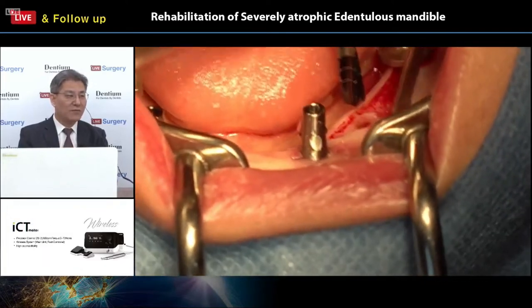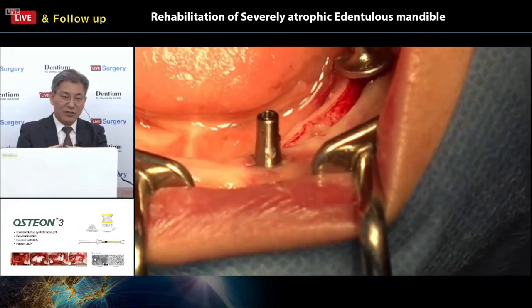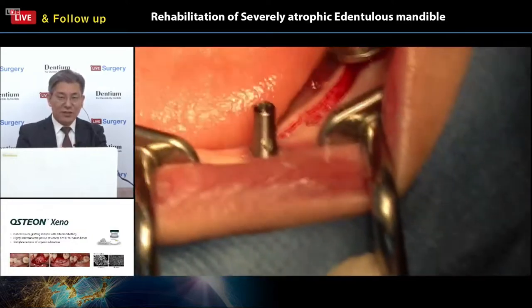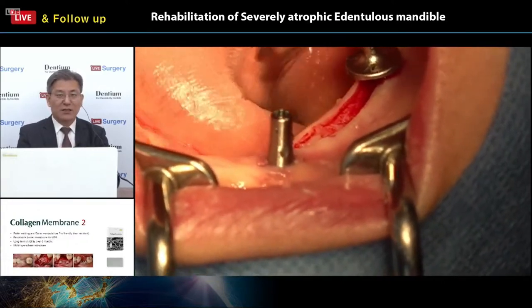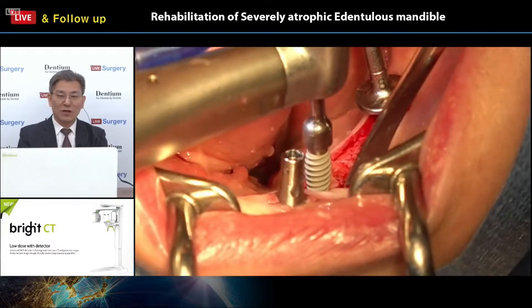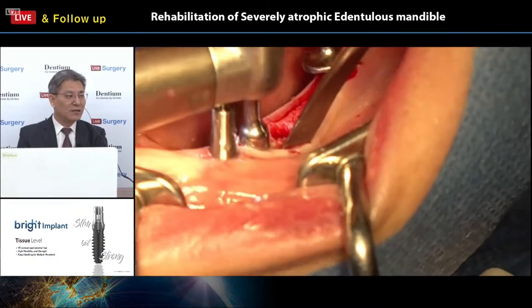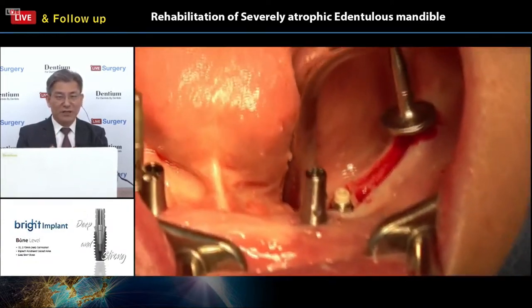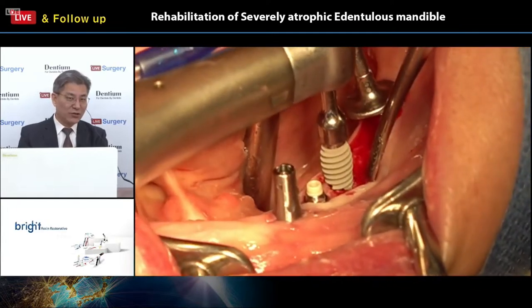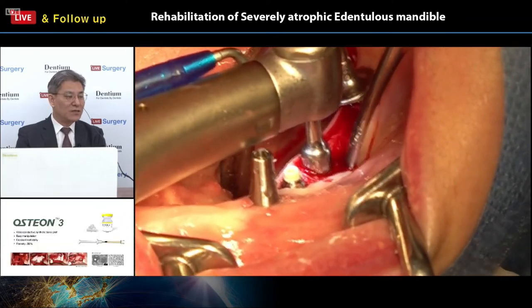This pin is a unique shape, a little bit like a dish style: a metal dish with a pole. So these metal dishes give us information about the final restoration, right? For the premolar, maybe 7-8 millimeter, the molar 9 millimeter, and the lower first molar, the biggest molar of our mouth, 10 millimeter in the mesiodistal dimension. So you can use this indication, the demarcated number on the insertion pin.